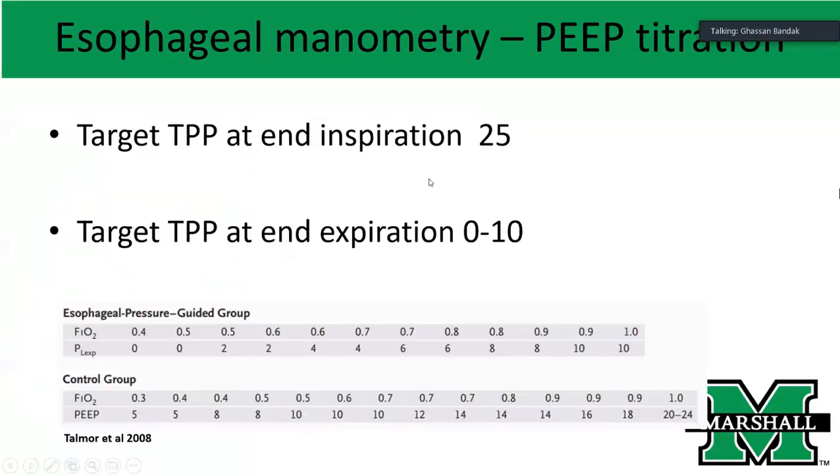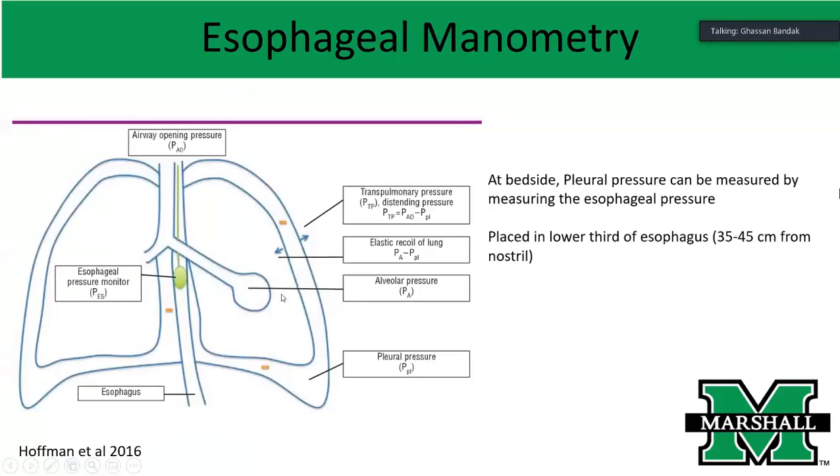I hope this image will be helpful to explain things more clearly. This is the alveoli, airways, and this is the trachea. When the vent measures airway pressures, it measures them here, and that involves the pressure within the airways, which we assume is the alveolar pressure.